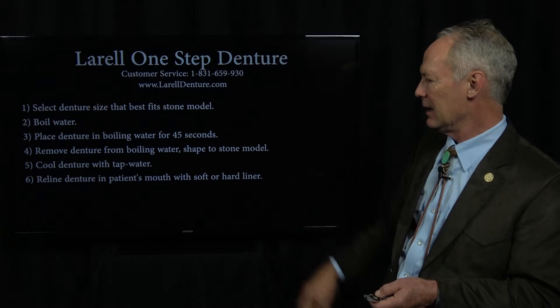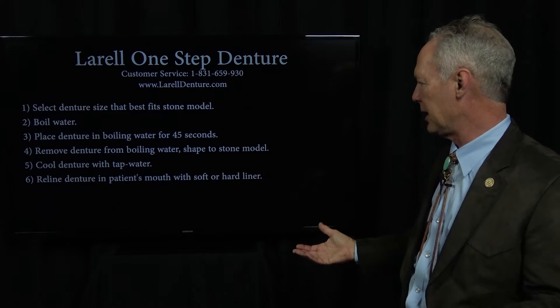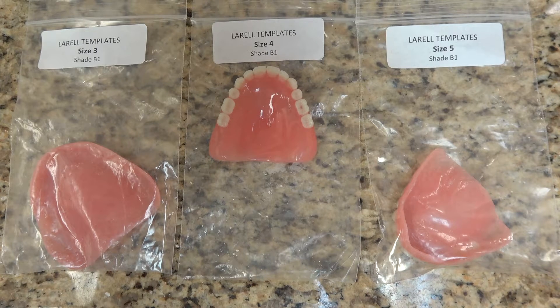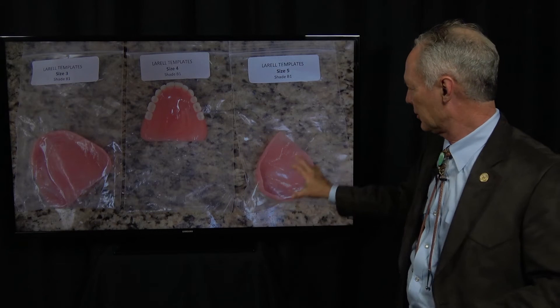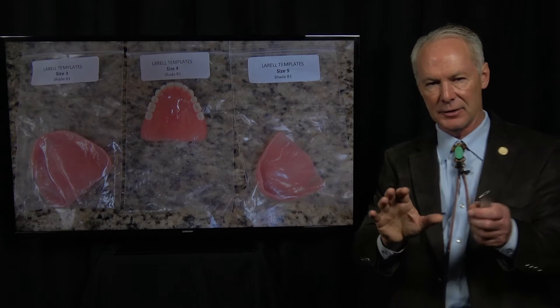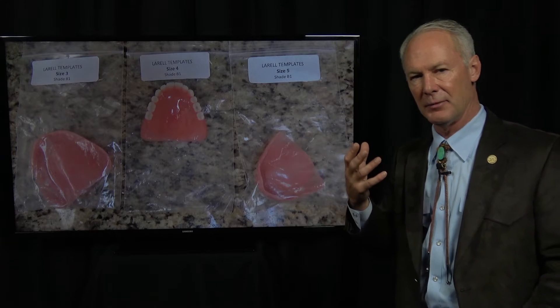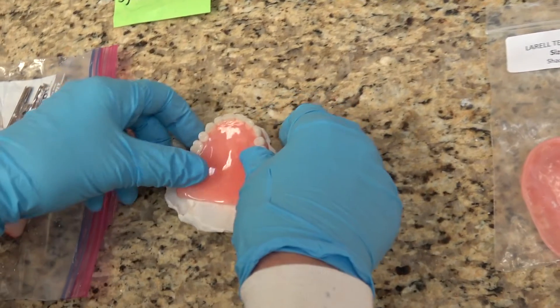It becomes softer, not real soft, but soft enough to mold it to the stone model. Then cool the denture with tap water, and reline the denture in the patient's mouth with soft or hard liner. These are the sizes — you can try them in while still in the plastic on the stone model, and see which one most closely fits the patient's arch.